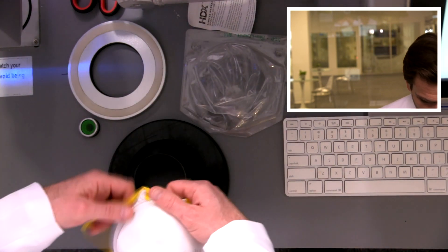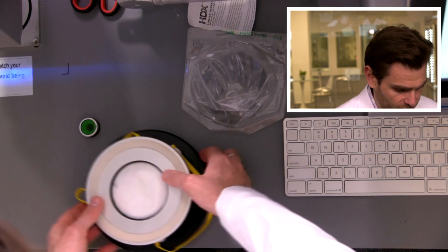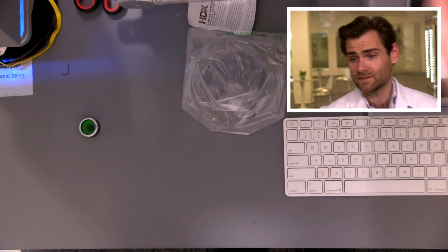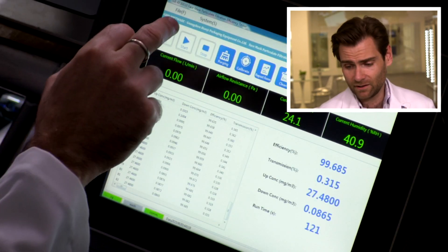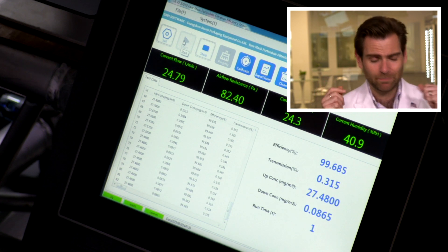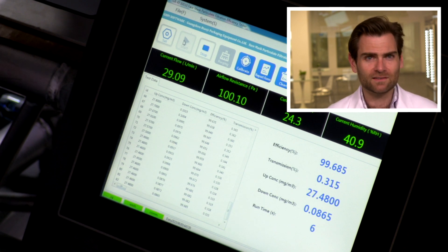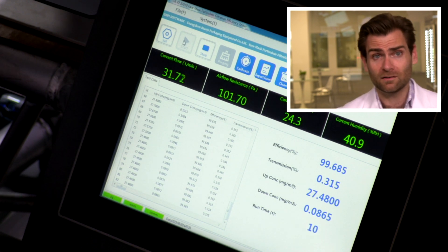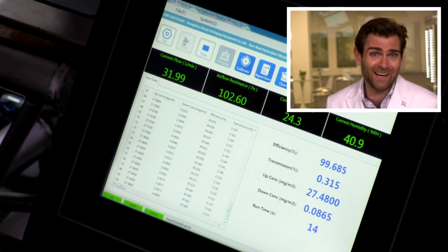I'm going to be using our setup here that is made for respirators. This is not the official way that NIOSH would be testing it — NIOSH uses very complicated methods, like beeswax to seal the mask. But we're doing the math here to give us the same result. This isn't what we even use for our actual respirator testing; this is just because I'm lazy and I don't like getting sticky.